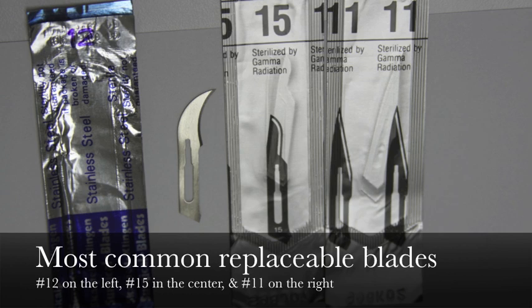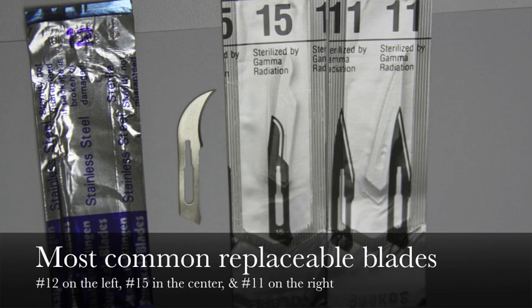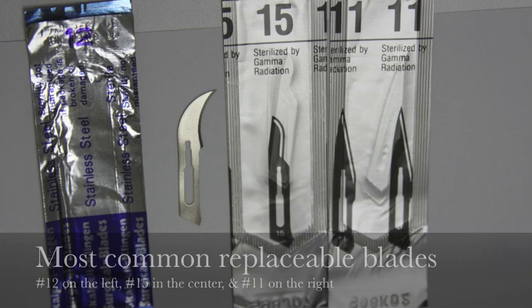This blade is very commonly used to do what is called an I&D, or an incise and drain, when people have abscesses. The sharp point of the blade pierces through the abscess, releasing the suppuration and blood that is causing so much of the pressure, and with it, the pain.